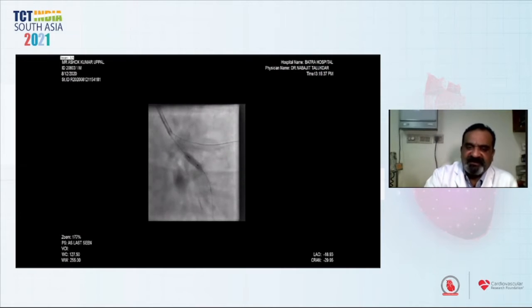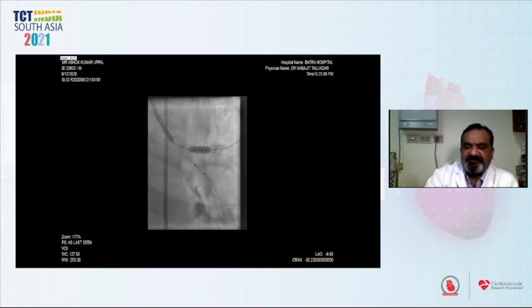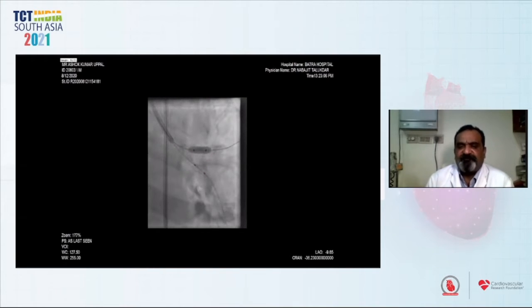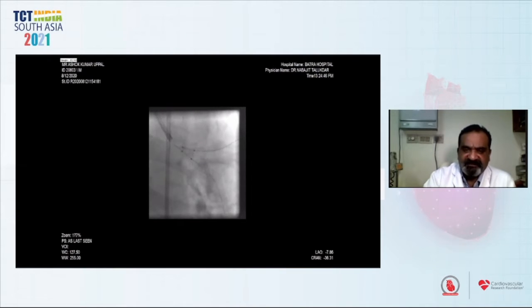We post-dilated the circumflex stent with a 3.5 by 8 mm balloon at 14 to 16 atmosphere pressure. Then we post-dilated the LAD stent with a 4.0 by 8 mm balloon, keeping the circumflex balloon in position with the intention to perform final kissing V-stenting. The LAD stent was post-dilated at 16 atmosphere pressure. Then we went for proximal optimization for both stents at 16 to 18 atmosphere pressure.